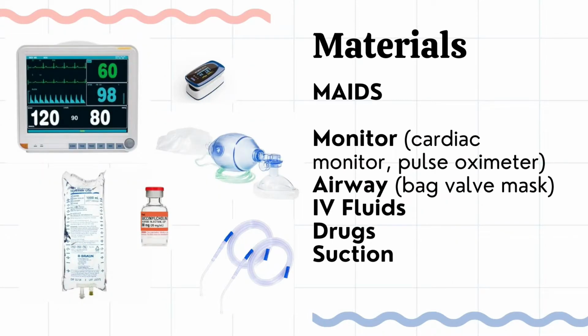For MAIDS, M for monitor including the cardiac monitor and the pulse oximeter, A for airway including the bag valve mask, I for IV fluids, D for drugs, which in this case we will use succinylcholine since the patient is hypotensive, and S for suction.